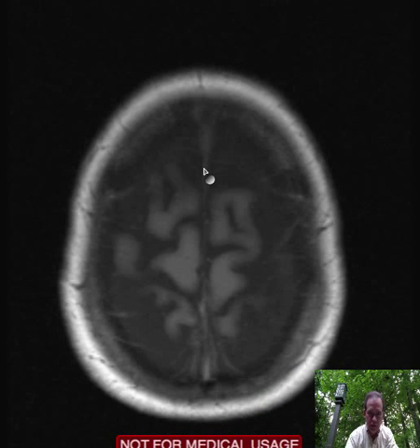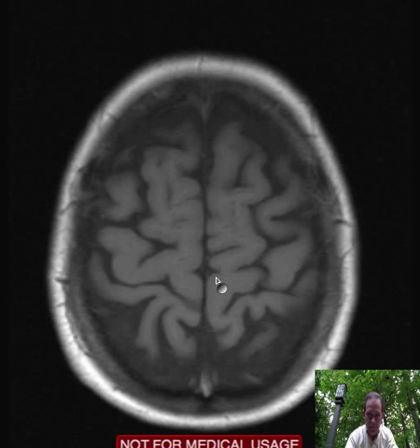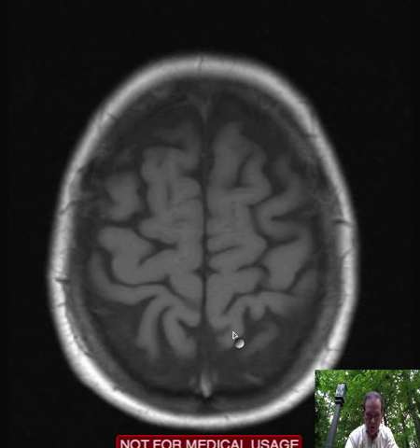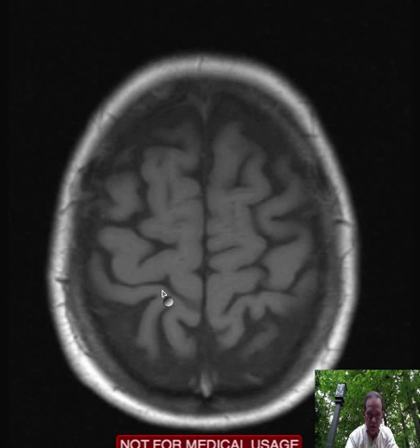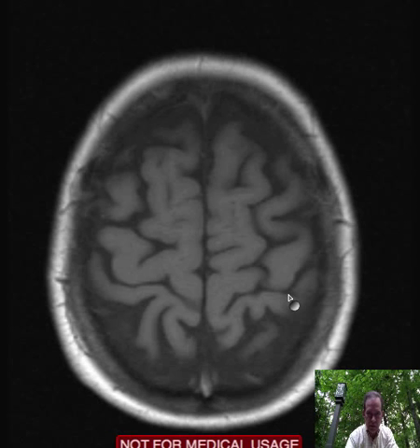Let's see if we have our friend the cingulate sulcus here. Yep, so here it is — going forward and to the left, this is the central sulcus on the right, and going forward and to the left, this is the central sulcus on the left.